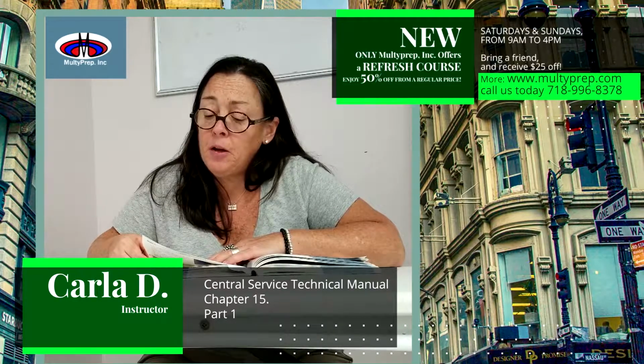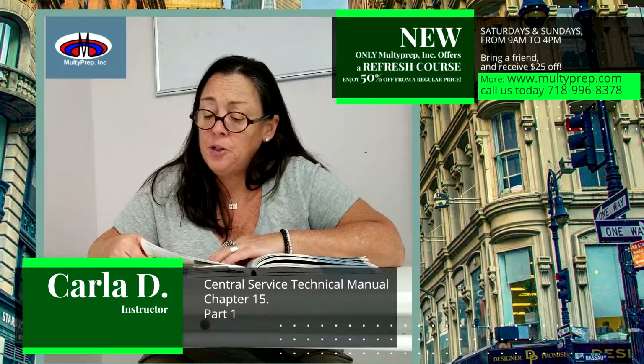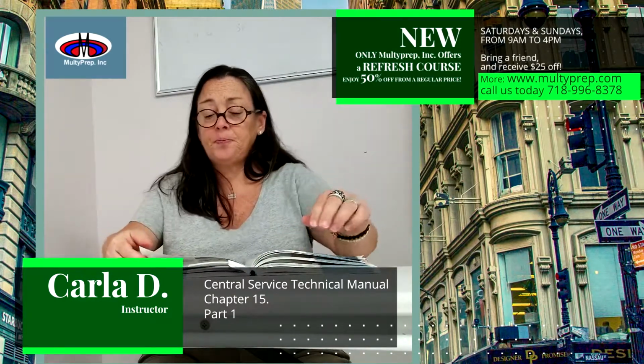Ventilation systems, exhaust lines, and floor drains should be periodically checked by qualified personnel to ensure they are working properly. Today's ETO sterilizers are designed for safety and have many engineering safeguards to prevent personnel from coming in contact with ETO vapor or liquid. In addition, environmental engineering controls protect CS technicians.